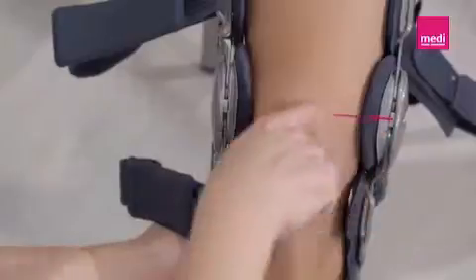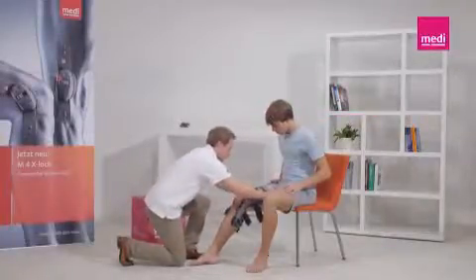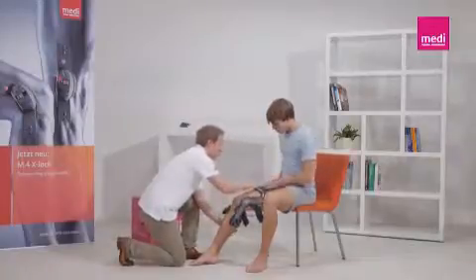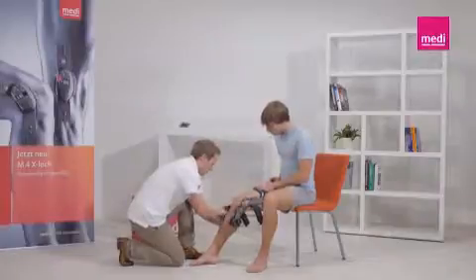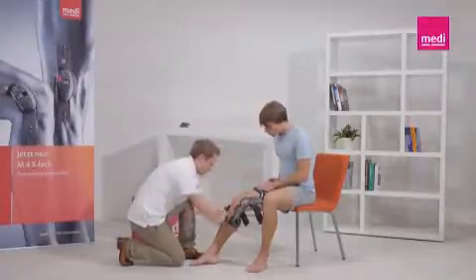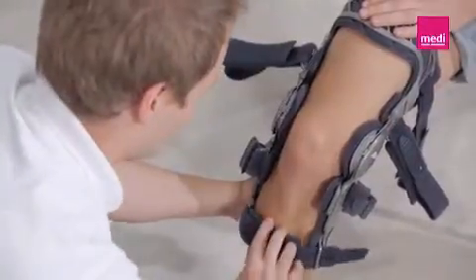Position the orthosis so that the middles of the hinges are at the level of the superior border of the kneecap. Make sure that the orthosis is not twisted on the leg. The straps should be secured in the order specified by the numbers to guarantee the orthosis fits securely and has the optimum effect.